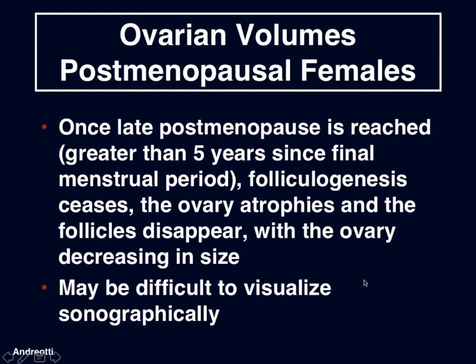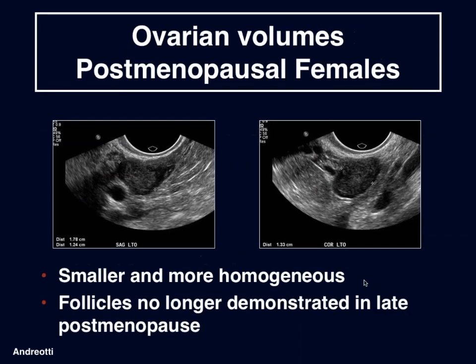And then we have postmenopausal females. So once late postmenopause is reached, and late postmenopause is considered greater than 5 years since the final menstrual period, at this point folliculogenesis ceases, the ovary atrophies, and the follicles disappear with the ovary decreasing in size. So it may really be difficult to visualize these ovaries sonographically.